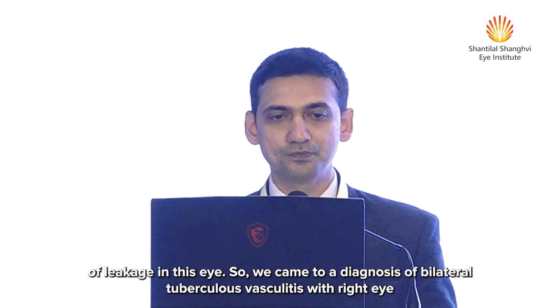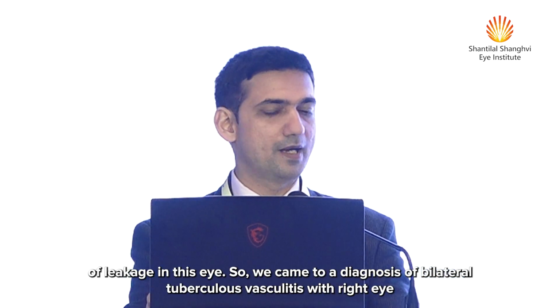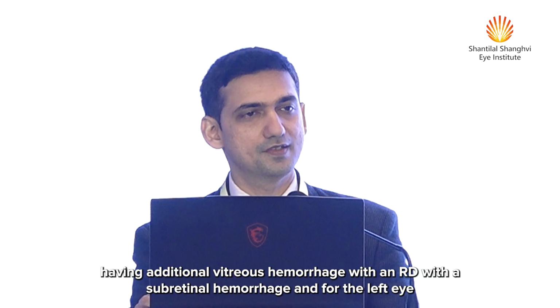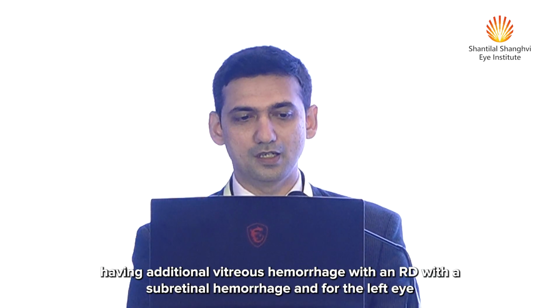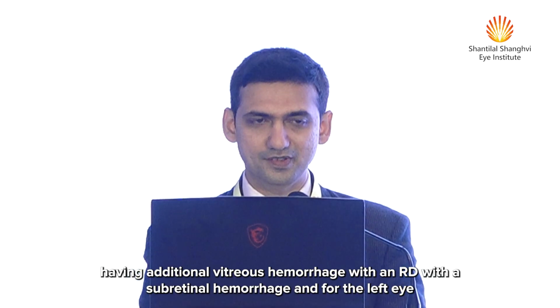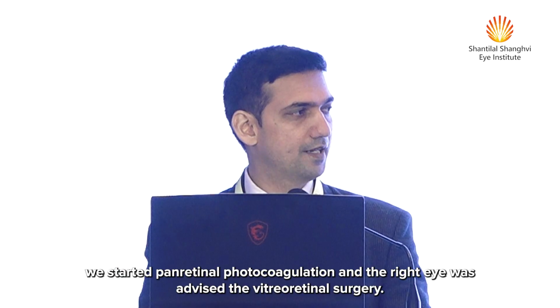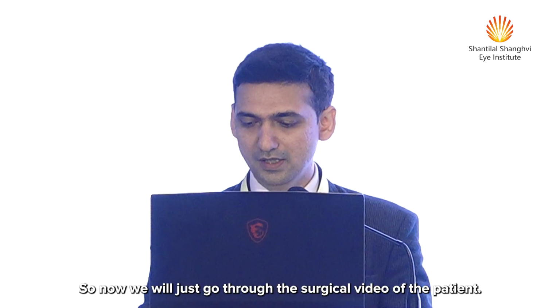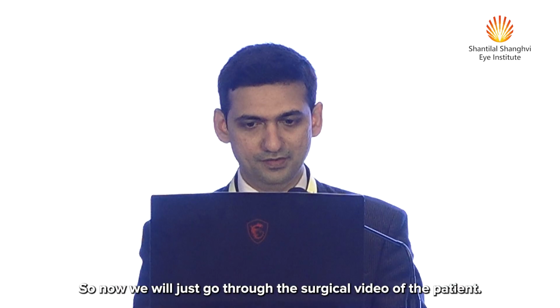So we came to a diagnosis of bilateral tuberculous vasculitis, with the right eye having additional vitreous hemorrhage with an RD and a subretinal hemorrhage. For the left eye, we started pan-retinal photocoagulation, and the right eye was advised vitreoretinal surgery. Now we'll go through the surgical video of the patient.